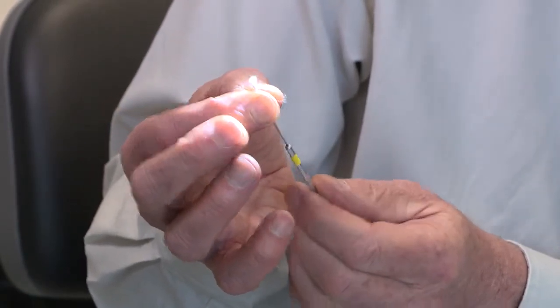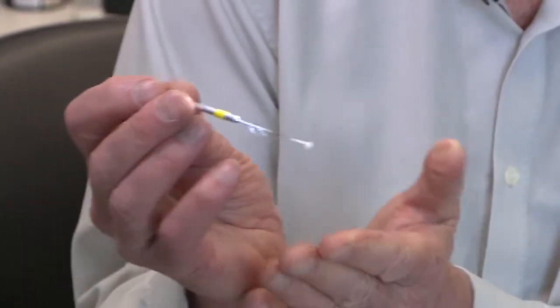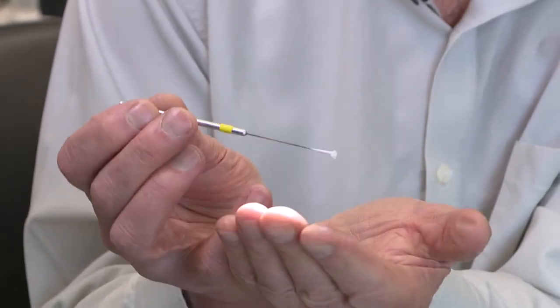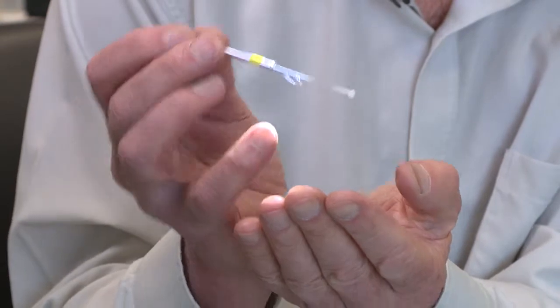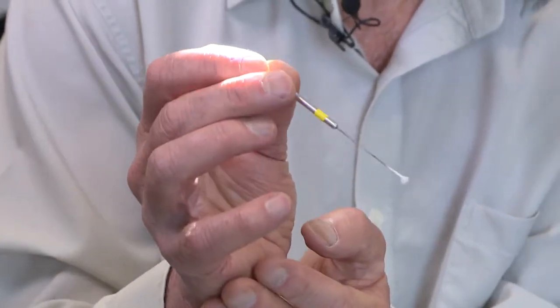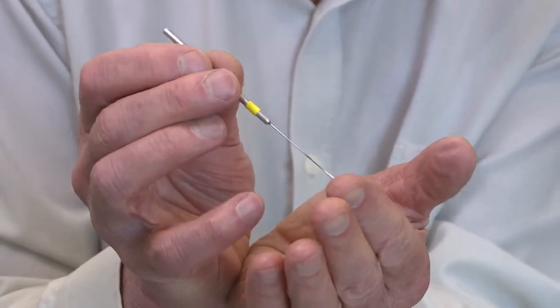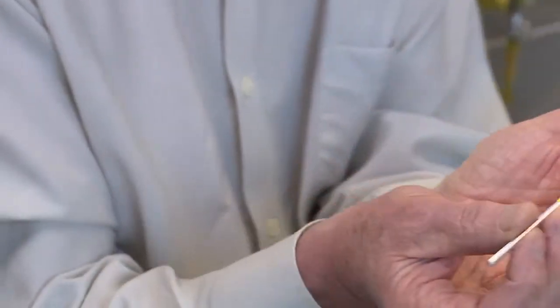You don't want them any bigger than that if it's an infection. Then you take it into the ear like we've already shown with wax rings, but in an infected ear especially you will not be able to see what it's doing. You can feel that it's sliding on the wall and eventually quite gently that it's got to the eardrum, and then you know you've done what you need to do. Very useful tool.